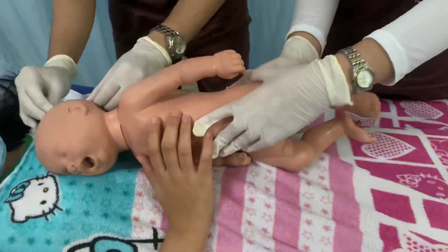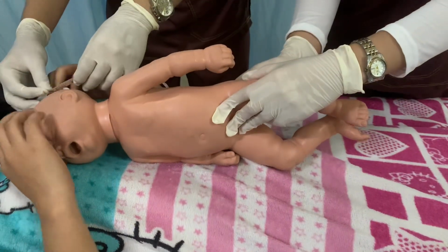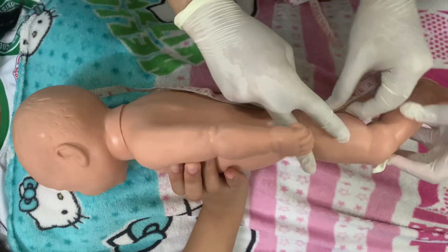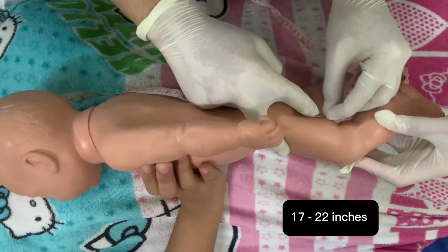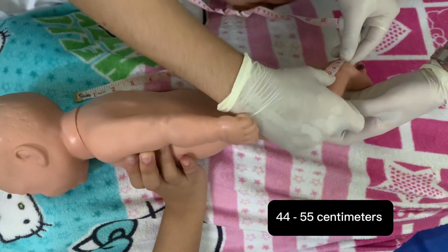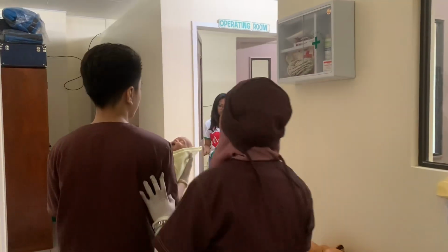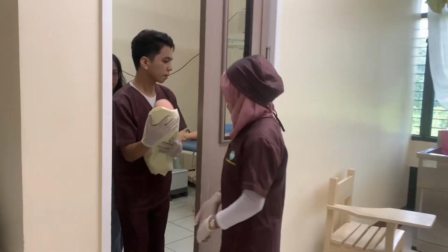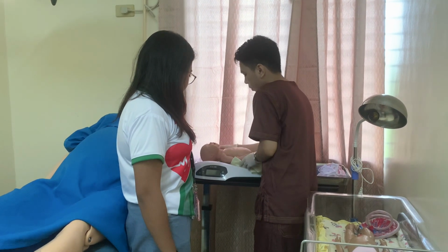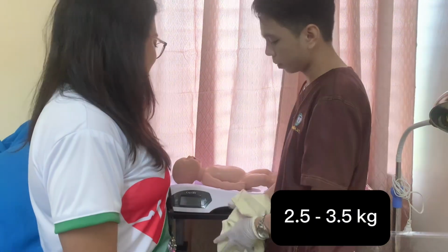For the length or height of the baby, you may need another person to help hold the infant still as you mark the length. Measure from head to heel and place the tape measure behind the infant to mark the length. Normally, the length should be around 17 to 22 inches, and in centimeters, it should be around 44 to 55 centimeters. For the weight of the newborn, remove all clothing and place the infant on the scale and obtain the weight. Normally, it should be around 2.5 to 3.5 kilograms.